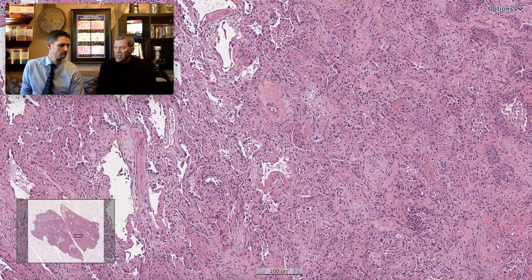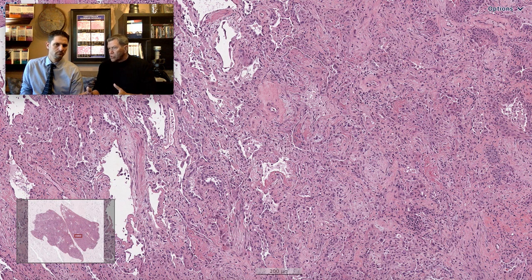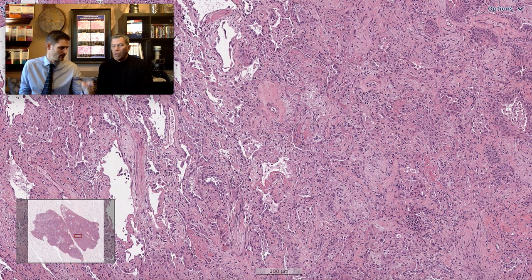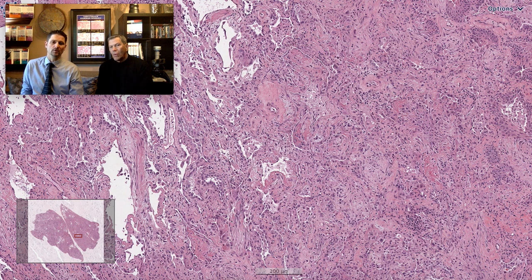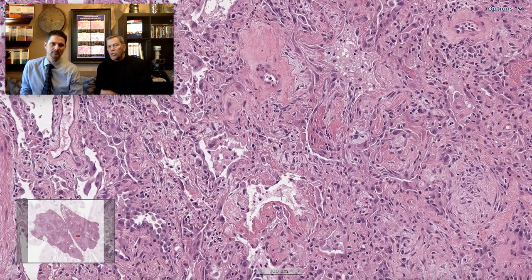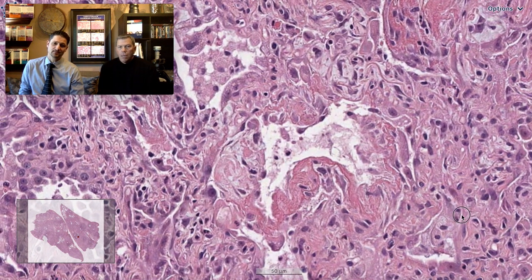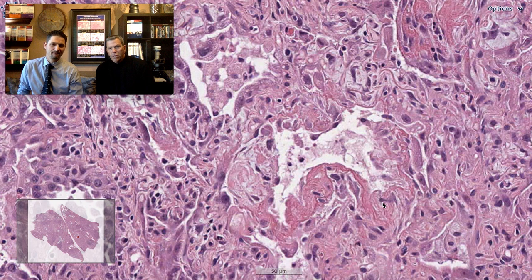Remember, when DAD occurs histopathologically with multiple phases of injury, you've got to think about drug. Because it implies repetitive injury over time — they didn't have one insult like one infection at time one, but they've been injured repetitively, as you might with a hypersensitivity or toxic reaction to a medication. So we need to find a hyaline membrane. And there it is — that was pretty easy. So there's a hyaline membrane here, there's organization. This is really acute and organizing diffuse alveolar damage by definition.